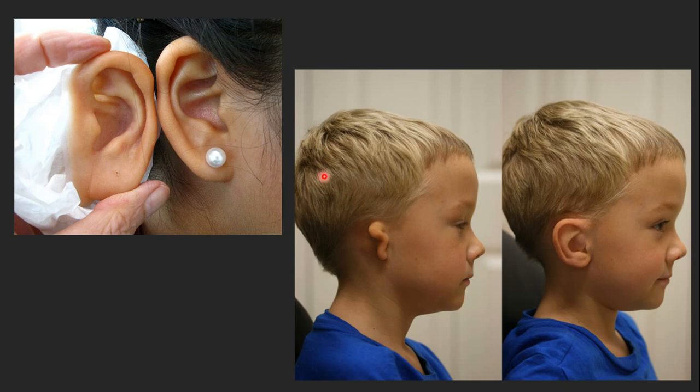In addition to hands and feet, people also make prosthetic ears and other things for cosmetic reasons. For example, this child over here on the right was born with an ear that has some kind of deformity. If you add this prosthetic ear, you almost can't even tell what his original ear looked like.